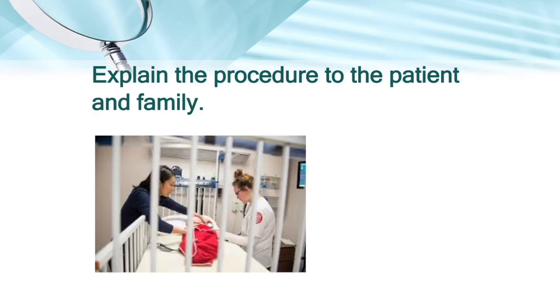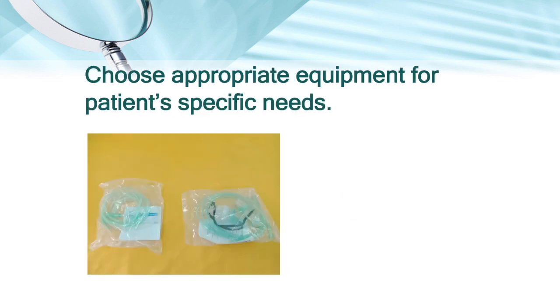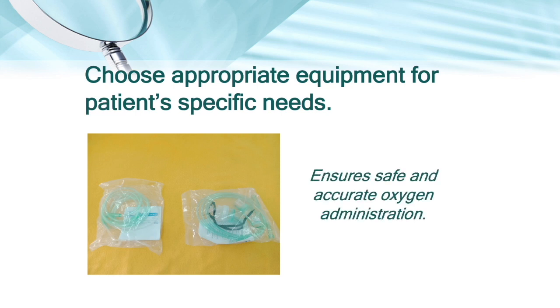Explain the procedure to the patient and family. This increases compliance and cooperation of the patient. Choose appropriate equipment for patient-specific needs. This ensures safe and accurate oxygen administration.